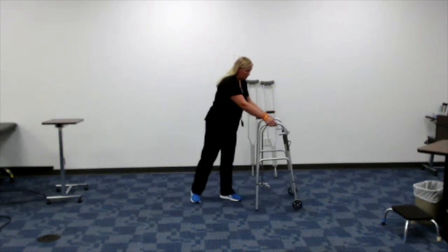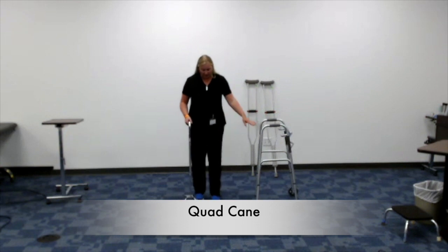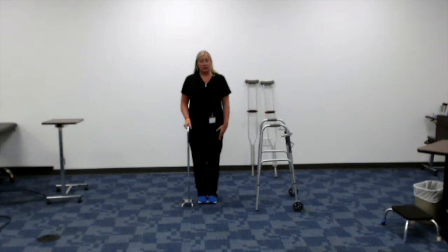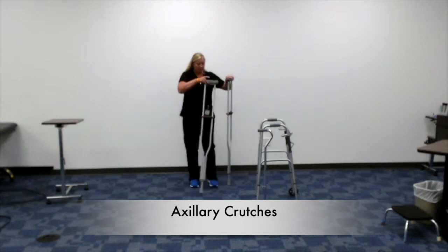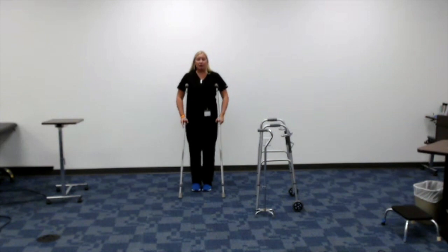As I'm going on to the next, this will be my quad cane. This is a narrow base quad cane. And as I'm looking at the landmarks, I can position this slightly lateral and anterior to my forefoot and go through the same 3 landmarks, the greater trochanter, the ulnar styloid, and then having a bend or elbow flexion of 20 to 25 degrees. Very similar to my quad cane are going to be the axillary crutches, because I can place them just slightly anteriorly and laterally for a 45-degree angle.